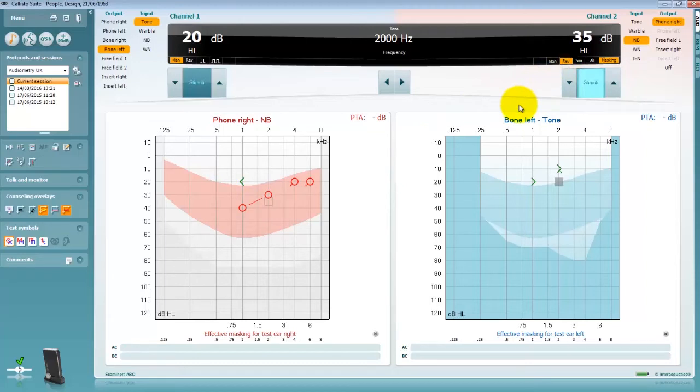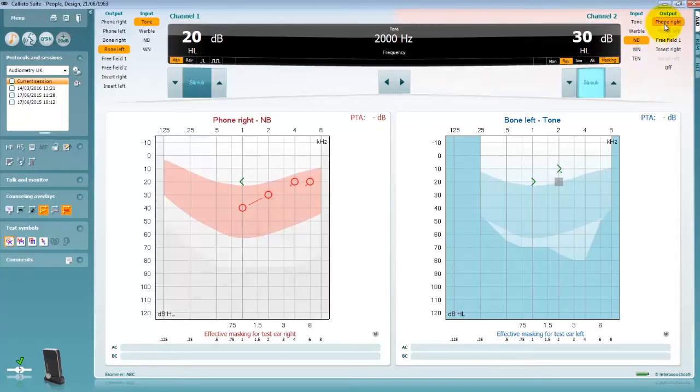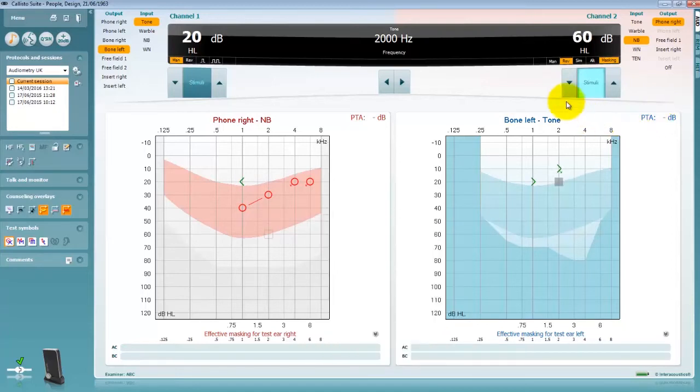Notice how the channel 2 stimuli button lights up when the masking is being played through the channel 2 transducer. The masking intensity can be controlled via the page up and page down shortcut keys or by clicking on the increase decrease intensity arrows for channel 2.